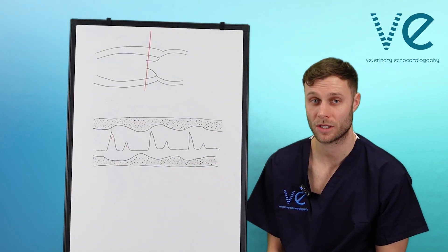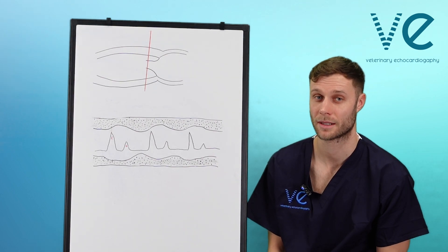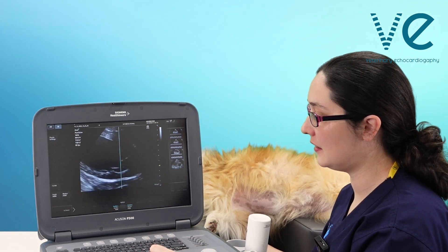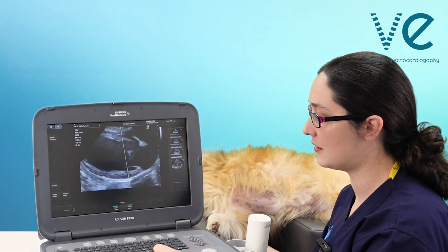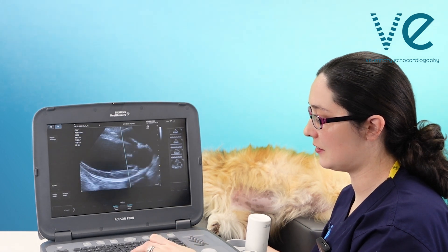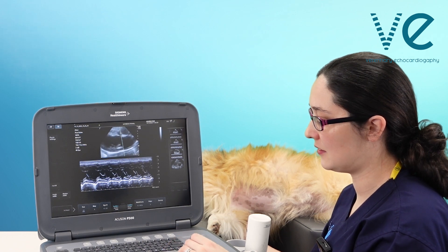Now we're going to do a live demonstration to walk you through how to take the measurement in both the long axis and short axis. When you have obtained and optimised your right parasternal long axis view, zooming in if you want to make it easier, press your M-mode and align the line with the tips of the mitral valve leaflets. When you feel you're in the right place, press M again to get your trace.